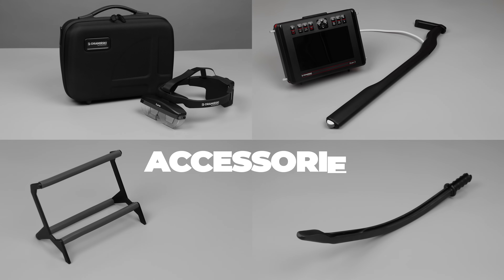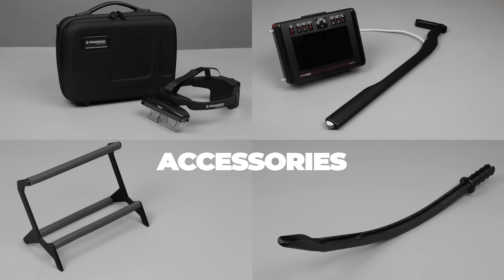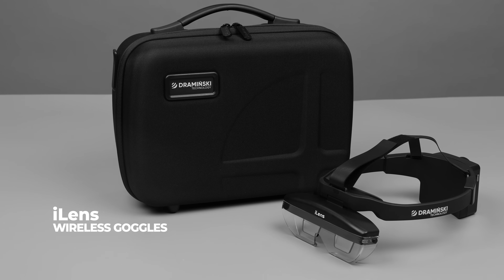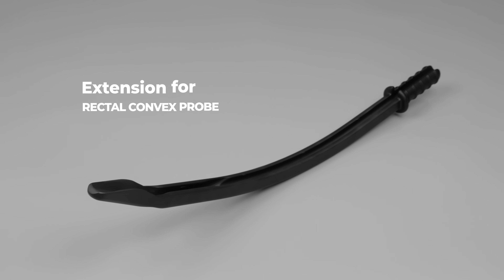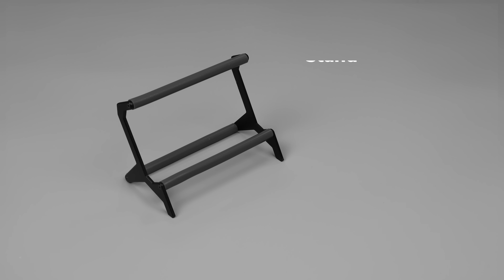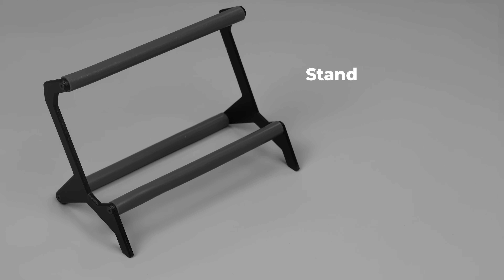Additional accessories are available to enhance the iScan3's versatility, such as the iLens wireless goggles for a hands-free viewing experience, the Draminsky Ovum pickup system for advanced reproductive applications, an extension for the rectal convex probe to increase reach, and a stand for convenient placement during examinations.